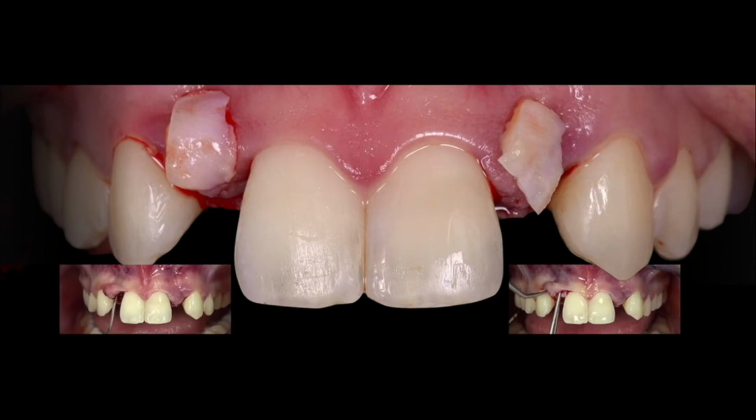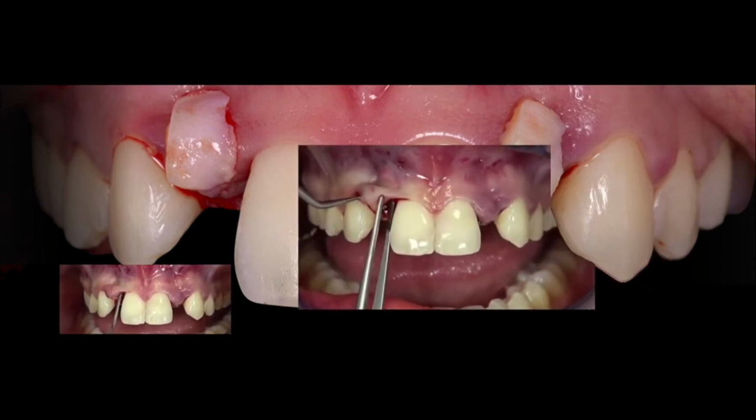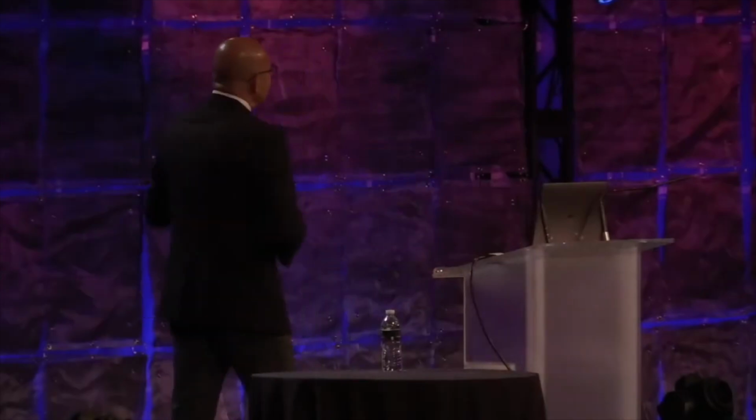So again, as we are working chairside for the provisional after implant placement, Eric is trying to build up the soft tissue to the level buccolingually that I wanted through my prosthetic design. And this is what he's filling up. And in 4 months, we get a very, very acceptable result.